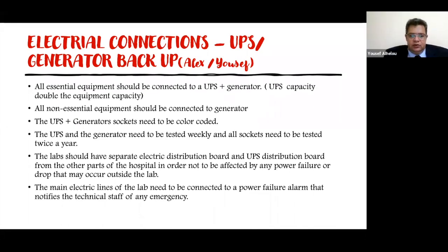Yes. To distinguish, we need to have the UPS sockets in a different color, so we will not by mistake overload the UPS. The UPS capacity should be almost double the total equipment capacity, so there will be no overload on the UPS, and it will give longer life.